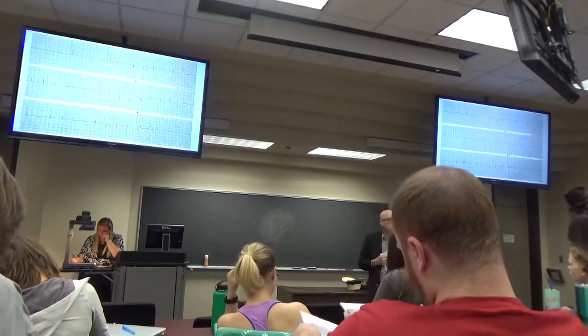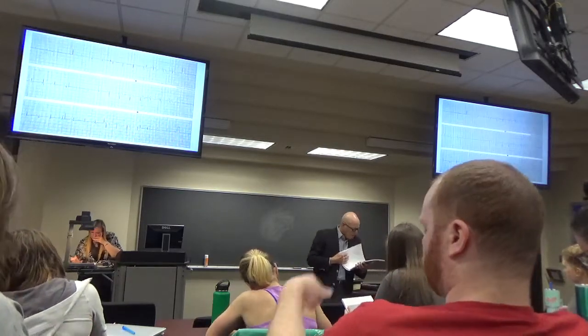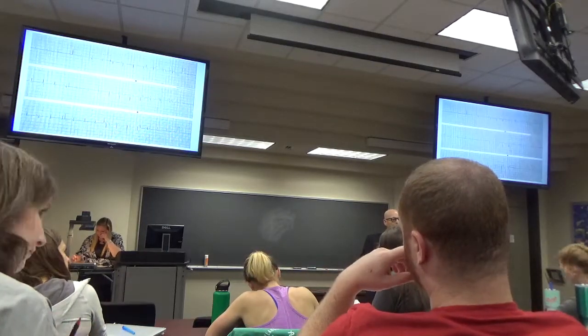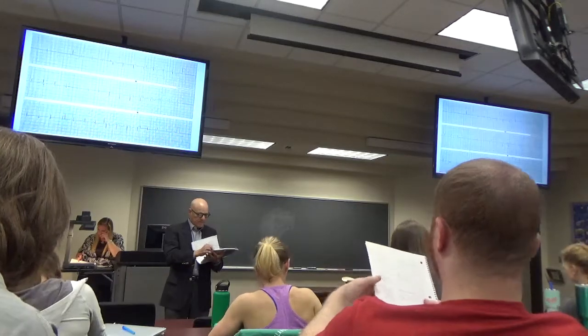That it's a biphasic P wave, the terminal portion is not very big. I wouldn't go very far on it. If I was worried about it, I'd get an echo. Other questions? 48?